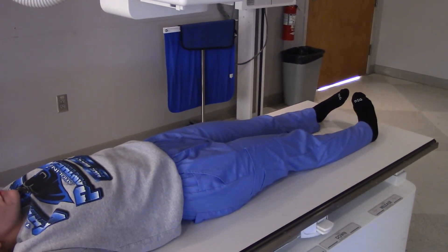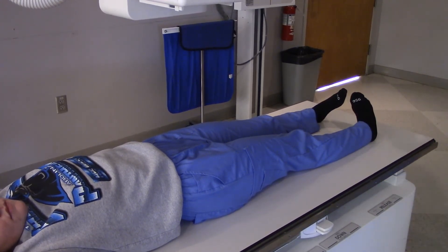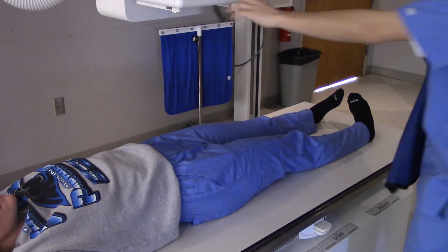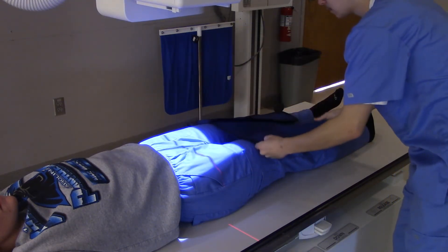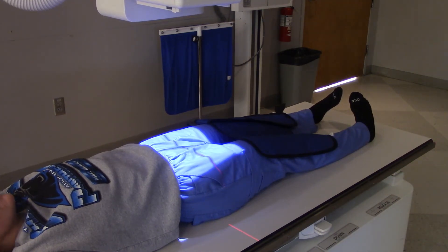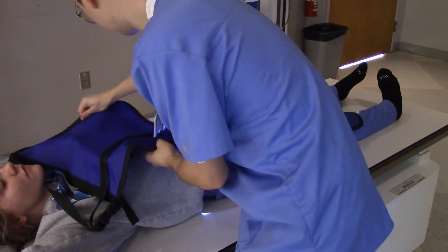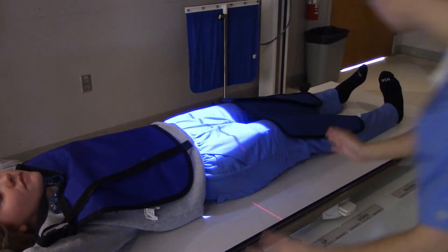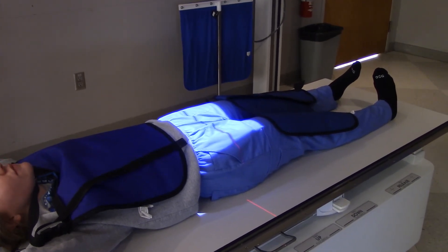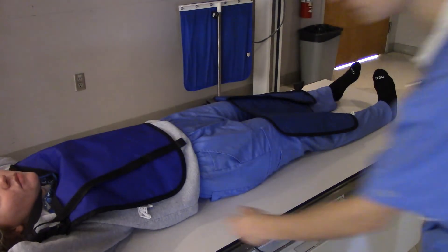Are you ready? Let's do it. Can we shield this patient? We can shield, but we have to be careful — you cannot shield anything that's inside the light field. You can shield the patient's femurs, you can shield the patient's breast tissue, you could put a thyroid shield on if you wanted. So we can shield everything except the pelvis. We're not in the light — shielding is good to go. Marker on, marker shield, shoot.